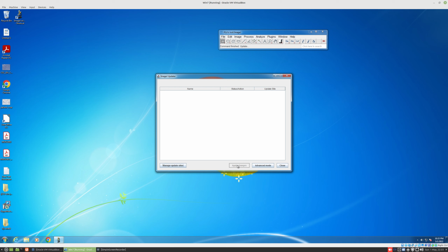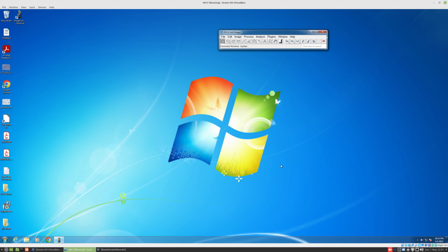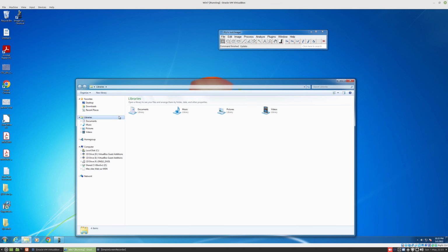Normally you should be capable to click on Apply Changes, which is not possible here because nothing was modified. And then eventually you'll close, and these two plugins will be added. When this will be done, you need to add the third script, which was written specifically for CPS PDL1 assessment. And in order to do that, you need to localize where you save this script. In this example, this script is saved in a peculiar directory. It will be totally different for your installation.